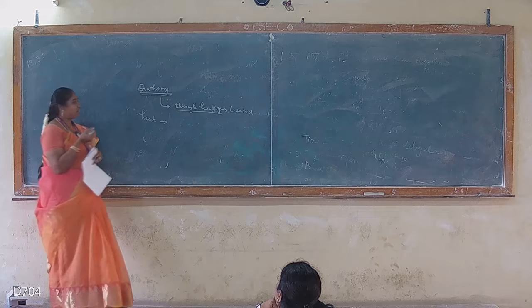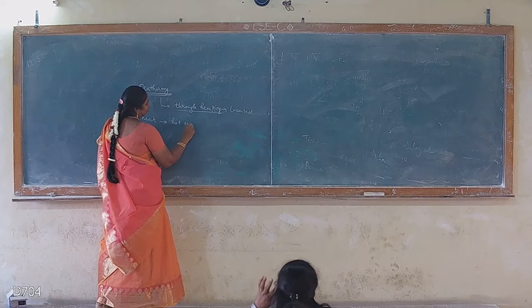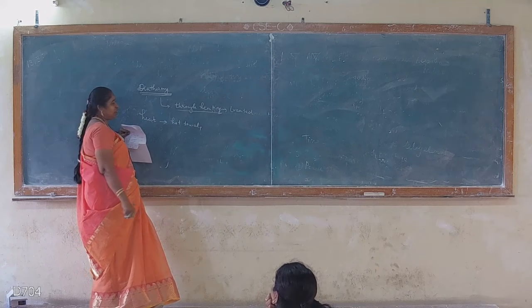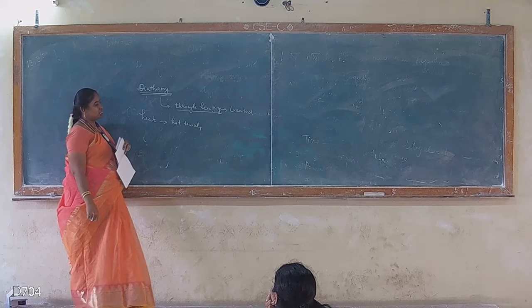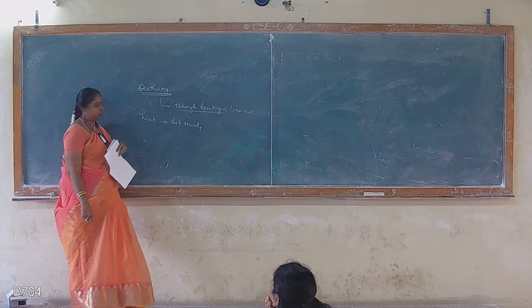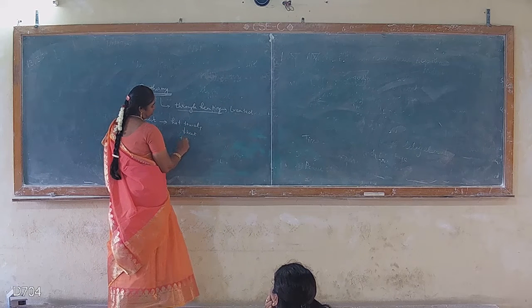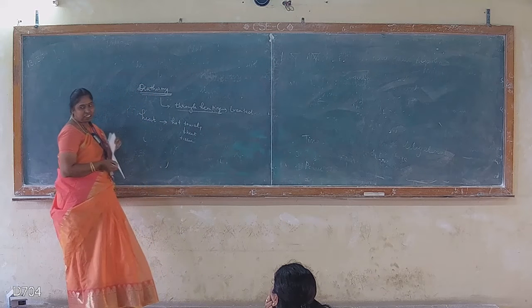just like applying a hot towel. That is our traditional treatment: whenever we have swelling, our ancestors or grandmothers treated it just by applying a hot towel over it, which means the heat is transferred to the human tissue. So that is the basic concept here.